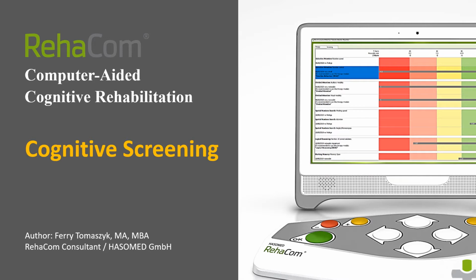I'm delighted to have you join me as I talk about cognitive screening and share knowledge on how to identify your patient's strengths and weaknesses efficiently and quickly with RehaCom.